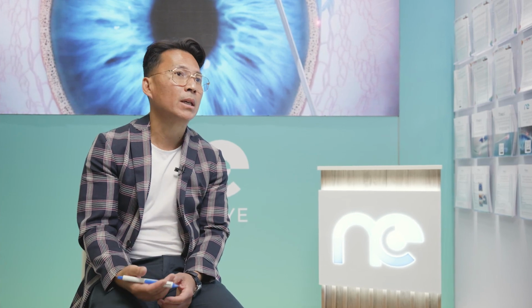The concept of canaloplasty really appeals in restoring physiology, because you're actually using the anatomy in your favor rather than creating a new anatomy, if you want. I think the beautiful thing about canaloplasty is it's maximizing the outflow pathway. There is no additional damage. Canaloplasty for me gives you the advantages of MIGS without having an implant. More physiological and normal not to have an implant.